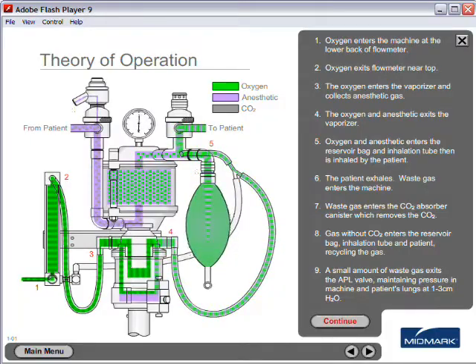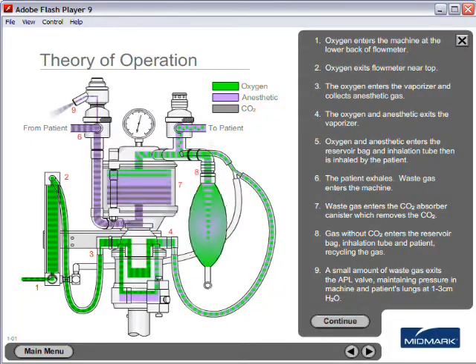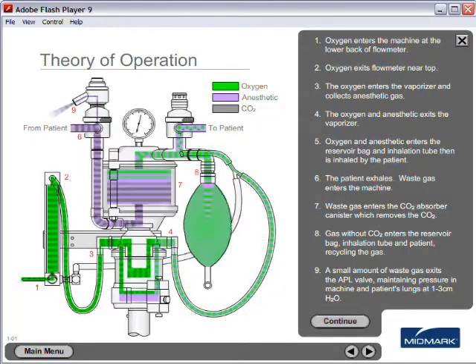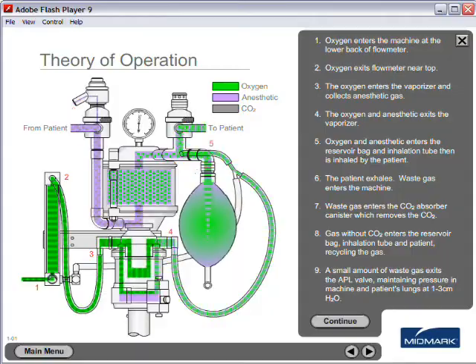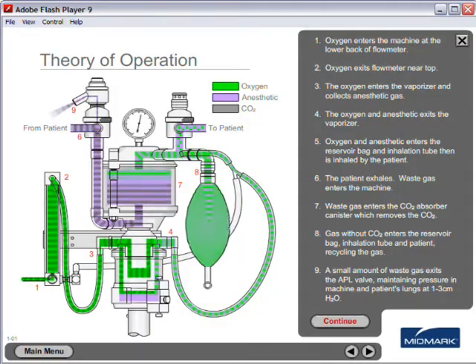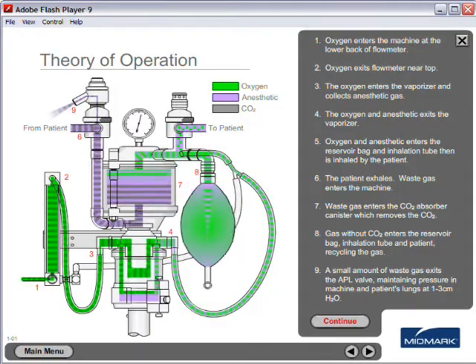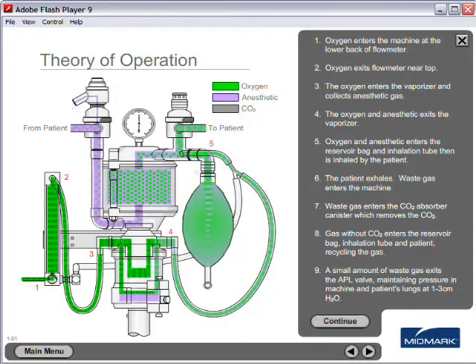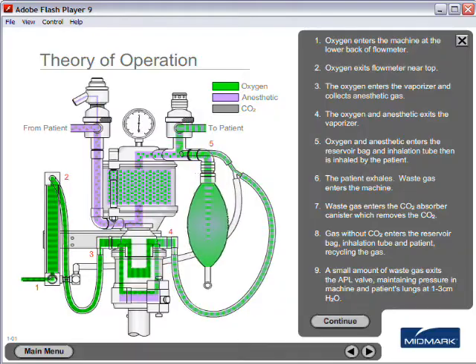The oxygen enters the vaporizer and collects anesthetic gas. The oxygen and anesthetic then exits the vaporizer.